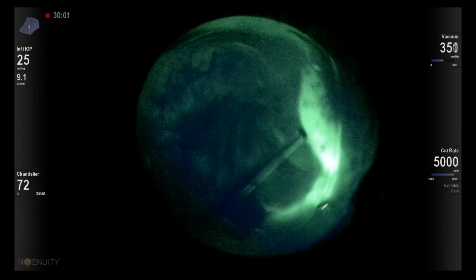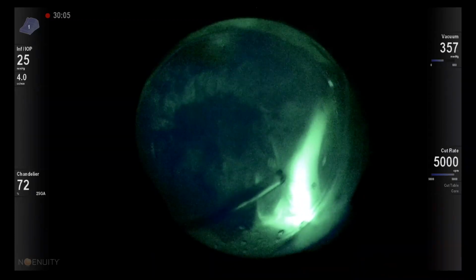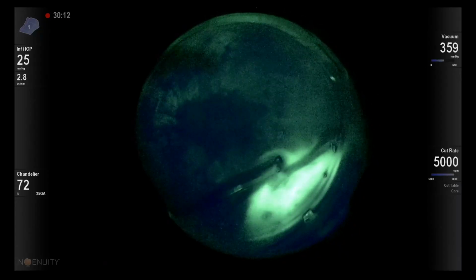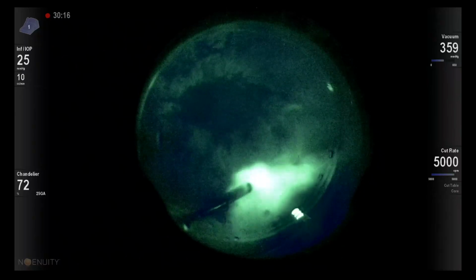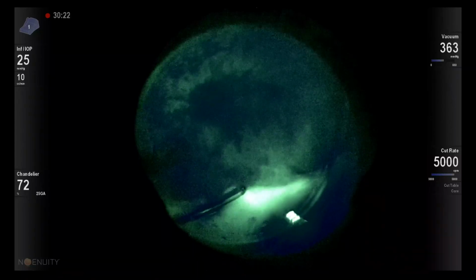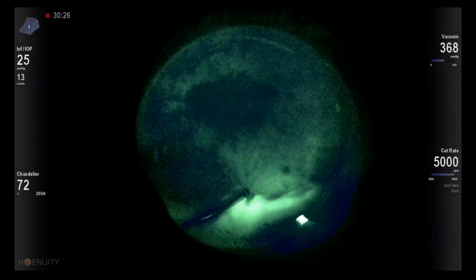And with the digital visualization and the filters that we can apply on the image, we can certainly see the underlying structures and underlying fluids. If you carefully look at the fundus, you will see a subretinal fluid which is stained with fluorescein, because this is a retinal detachment.